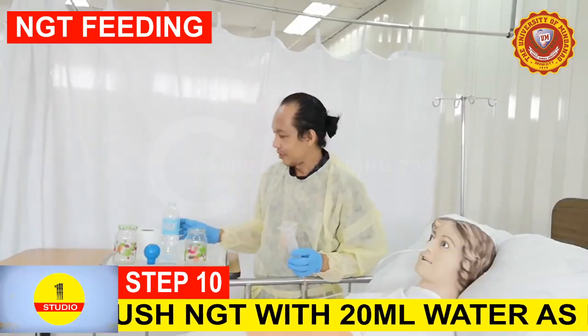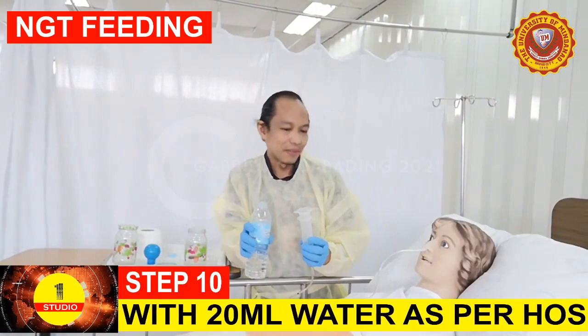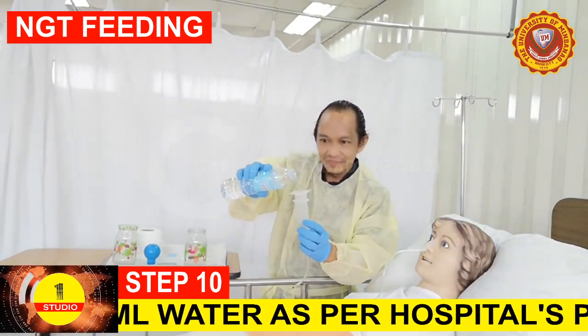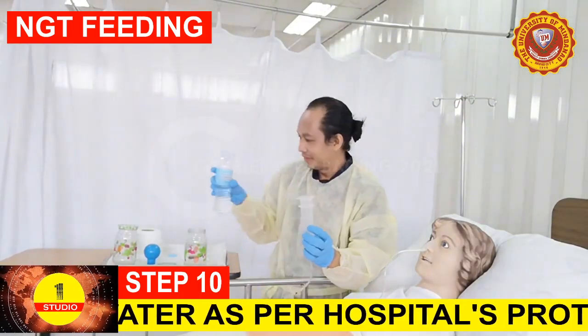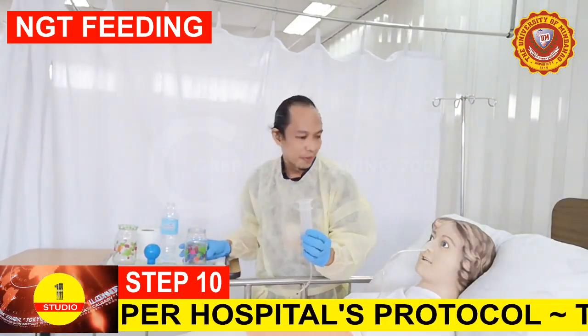Step 10. Flush the nasogastric tube with 20 mL of water, then administer the correct volume of prescribed calculated feeding formula.